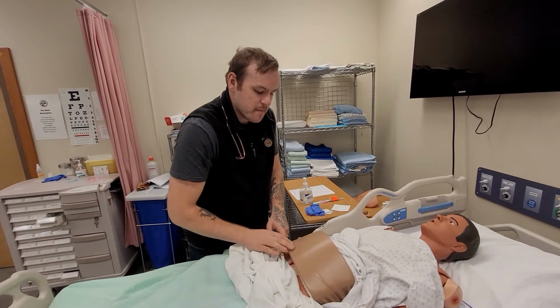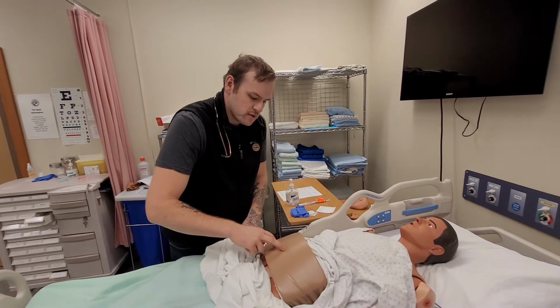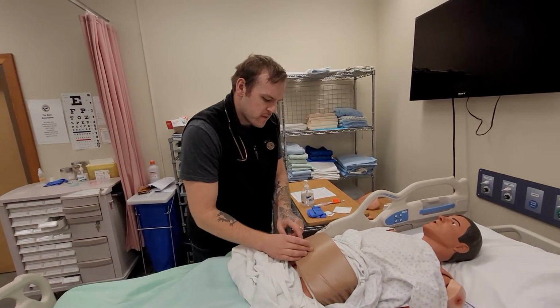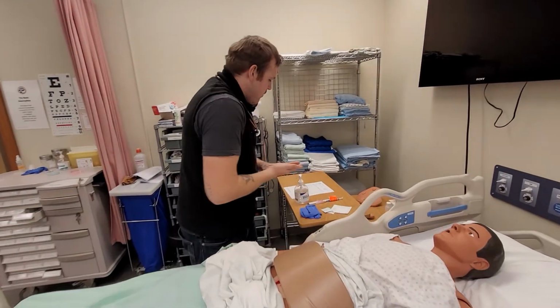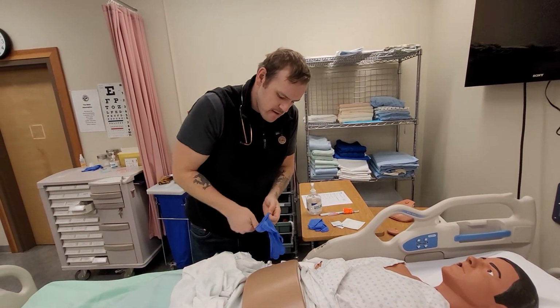Okay, so for landmarking, what I'm going to do is basically create a triangle on your abdomen here from your 2 iliac crests to just about your umbilicus region here. And in that area, I'm going to come down to the lower end, and we want to go about 2 inches away from your umbilicus. So that puts us right about here. So what I'm going to do, perform hand hygiene again. I'm going to don my clean gloves at the bedside here.